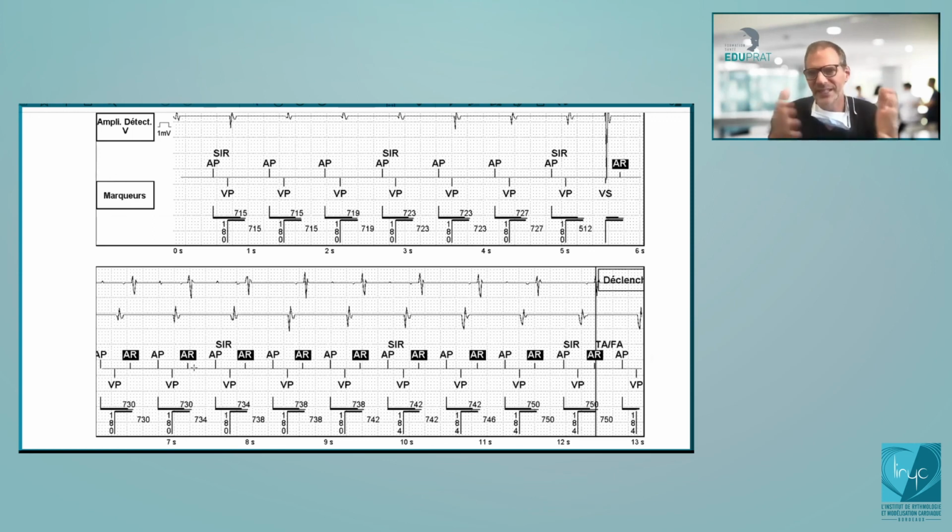Okay? So in this patient, remember, if there is a retrograde conduction, there is a dilemma. If the signal falls inside the PVARP, you will not have any PMT, but you may have this kind of problem. If it is outside the PVARP, when there is retrograde conduction, then you will have a higher risk of PMT, but not this kind of problem. Okay? So any questions? No? Everything is clear about Abbott devices?